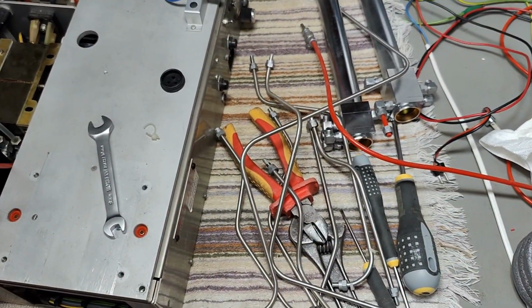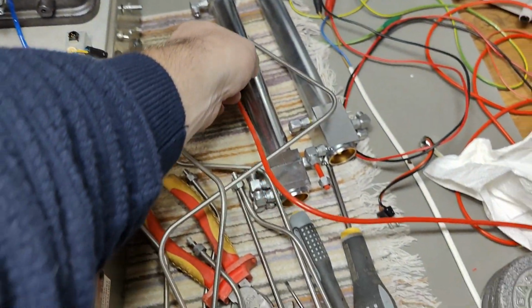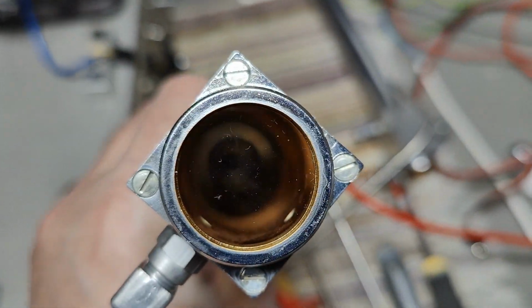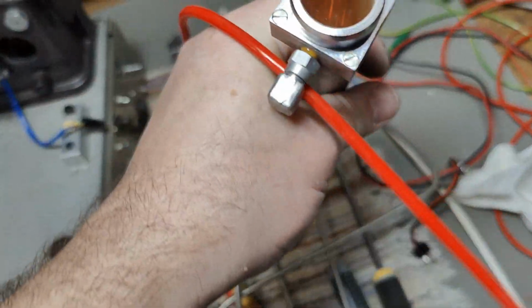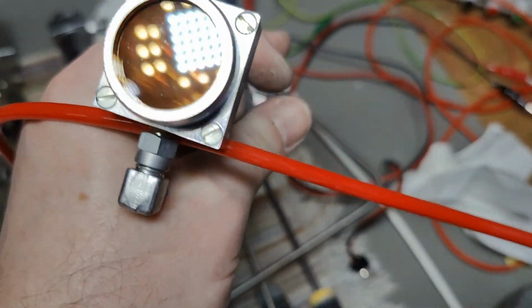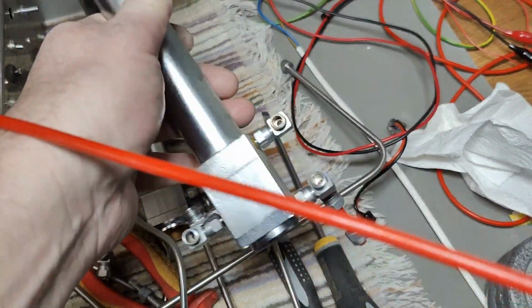I think I now know why this unit blew itself up. Of course, the two different detectors, or sensors if you want. You can look through them. I don't know if I can get this into focus, but you can see this one is nice and clean all the way, right? So I bet this is the reference sample. So the other one, look at that. It's completely dirty down there. You can't see a damn thing half the way through it. We got another little glass down here, and all that is totally dirty.